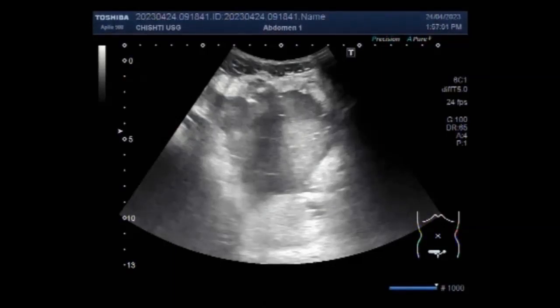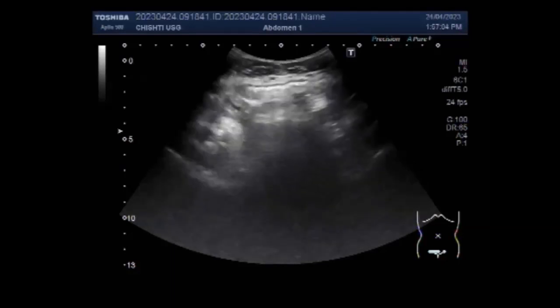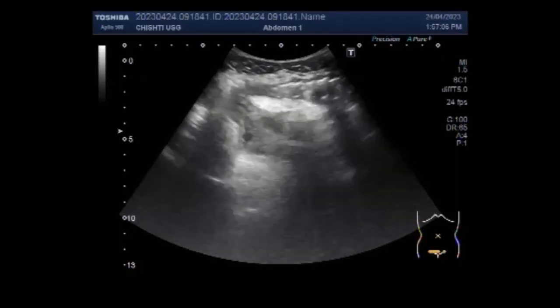Dear viewers, I hope you are all fine. This ultrasound video shows a case of intestinal obstruction with perforation.